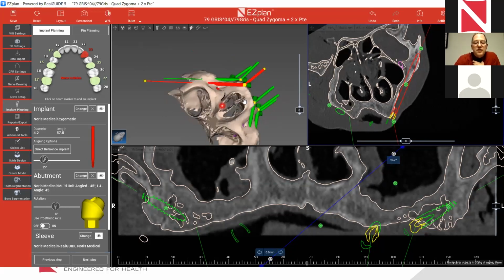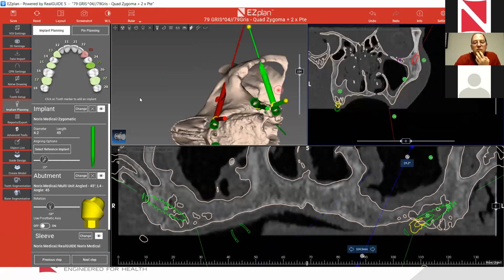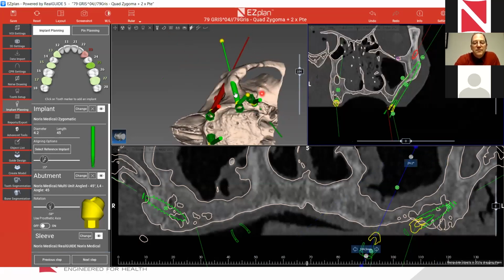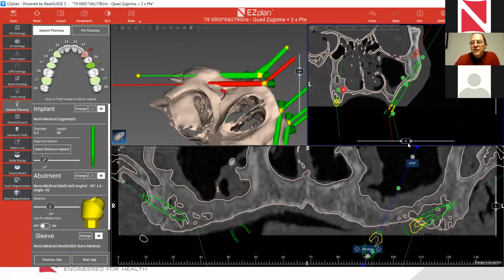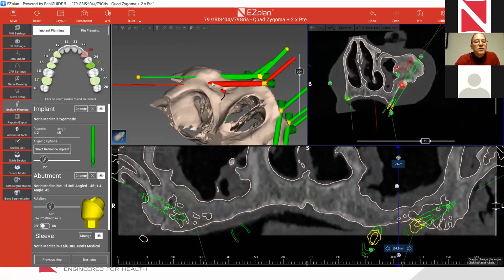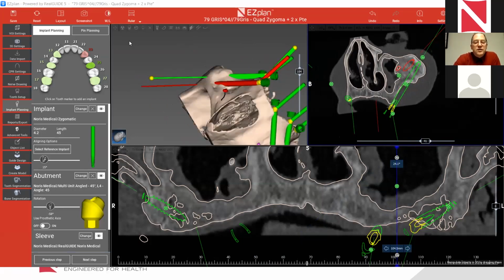Just look how easy it is. If I had the anterior implant positioned that way, okay, the only thing I need to do right now is bring the posterior implant to position to find the entering point, which I'll show how we do that, okay? And we need to look from this side that we have a gap, and then we're not colliding. That's all. So we have a relating point that we're not colliding. Okay, I hope I answered this question. This was the answer to Muhammad.